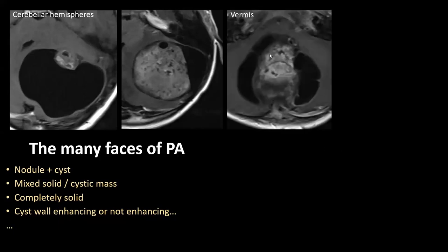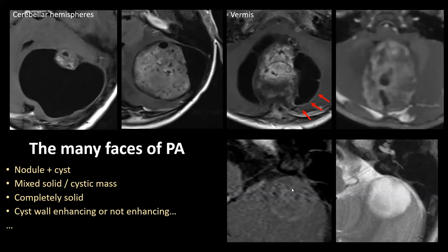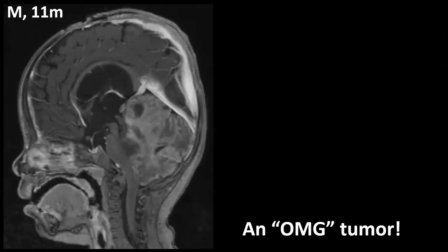Here we have a large nodular component surrounded by cystic components in the hemispheres. This is a midline tumor in the vermis with faint cyst wall enhancement. Here is a predominantly solid pilocytic astrocytoma without surrounding cysts. And here a completely solid mass, hyperintense on T2-weighted images with very faint enhancement. So the appearance can be more heterogeneous than just the classic cyst with nodule. Keep that in mind — it is still the most frequent tumor in the cerebellum in children.